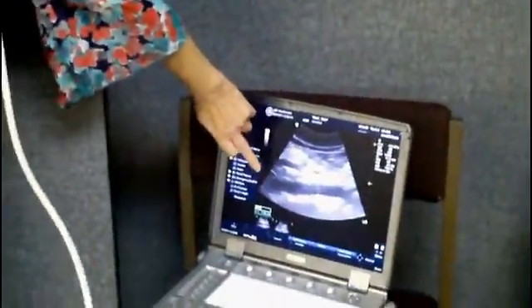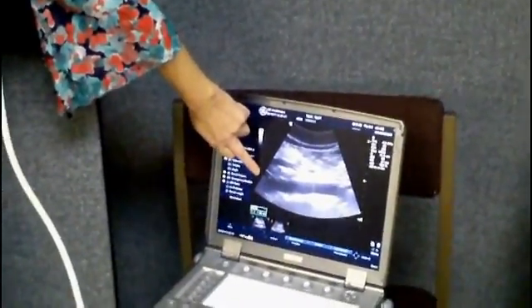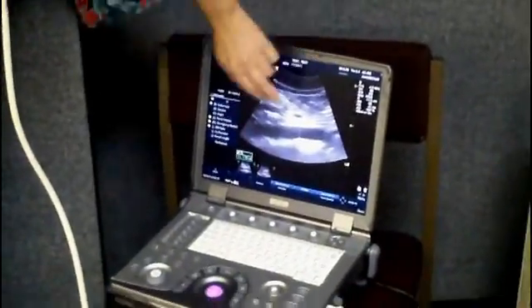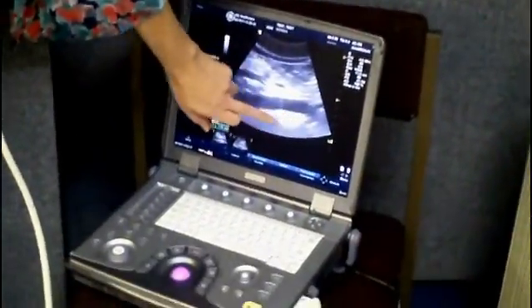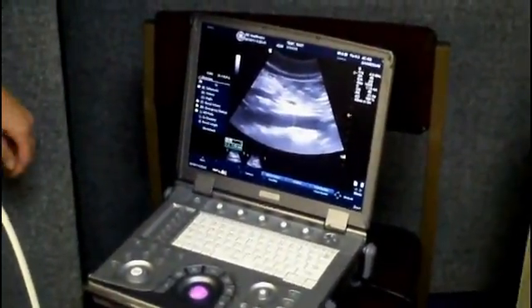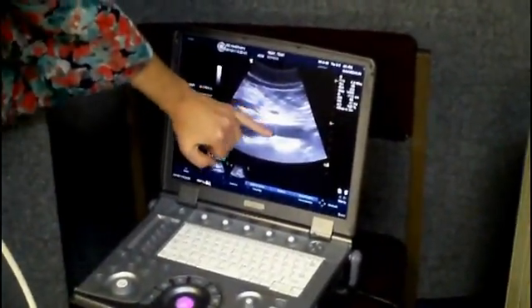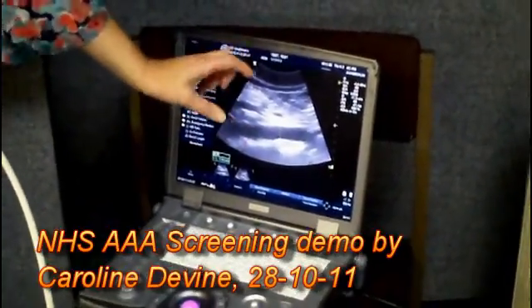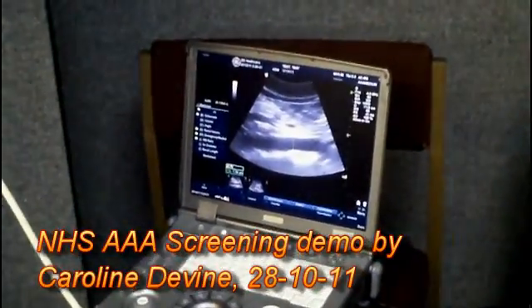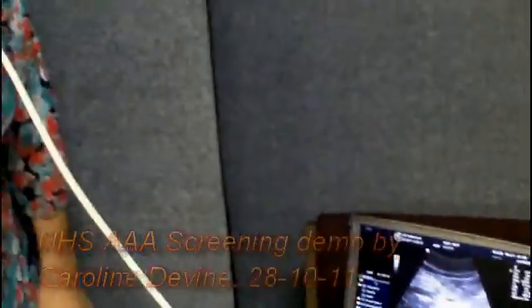What we're seeing here — this image — is Andrew's head at this end, his feet down this end, this is his tummy here. The white shadowing here is his spine, and this black tube going through is the aorta. We measure at the widest part — I'm just demonstrating here — but basically we would measure that to confirm he's got a nice normal aorta. Well, there's something normal about Andrew!